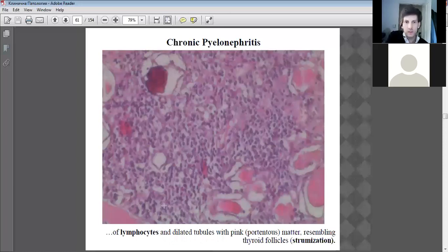So I said that there are slightly lighter nucleated cells. Here's one here, there. Across, there's another one there, another one there. They're everywhere. If you look closely, they're dotted almost everywhere. Yeah, a massive invasion of lymphocytes and big spaces forming as a consequence of the death of tissue. So we're almost out of time.